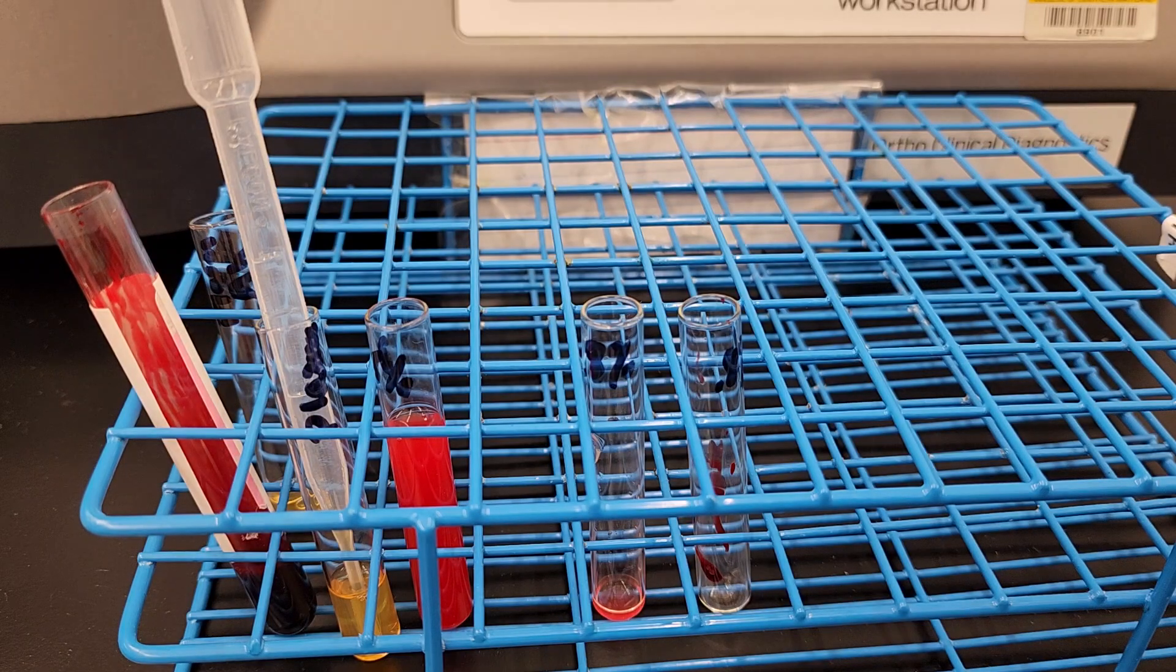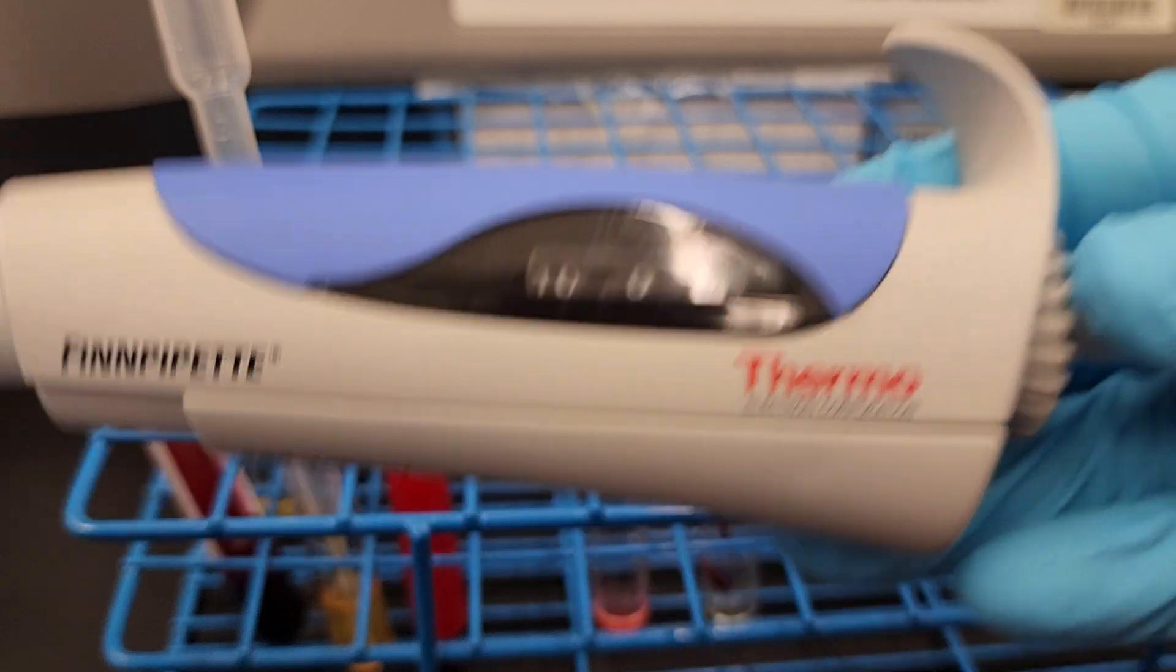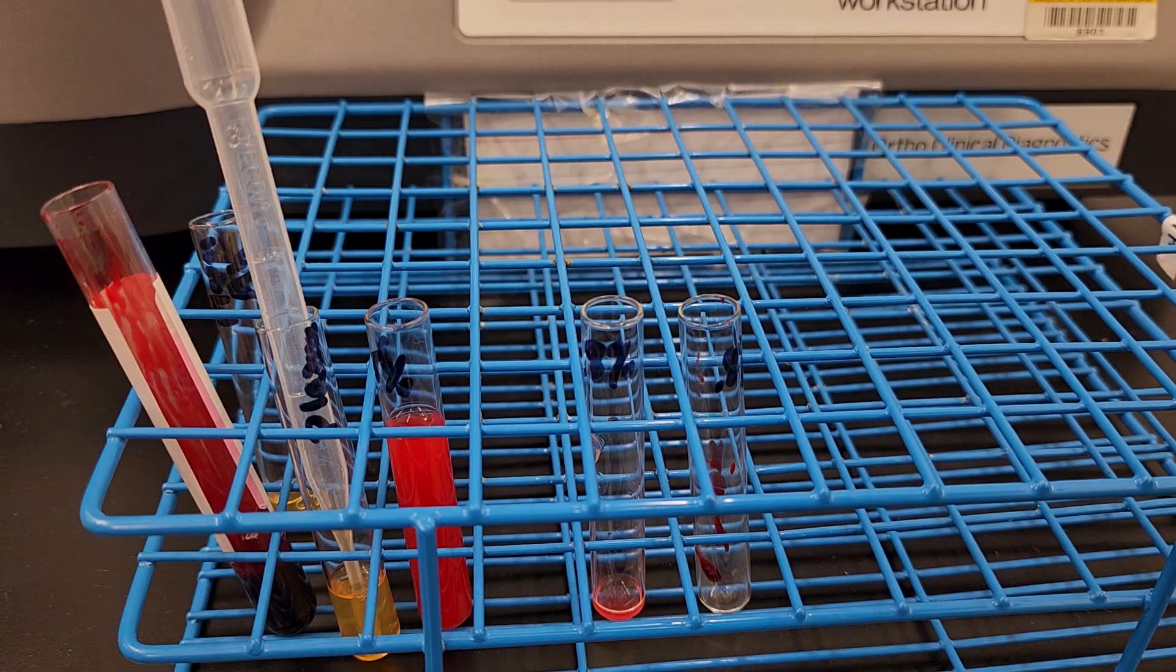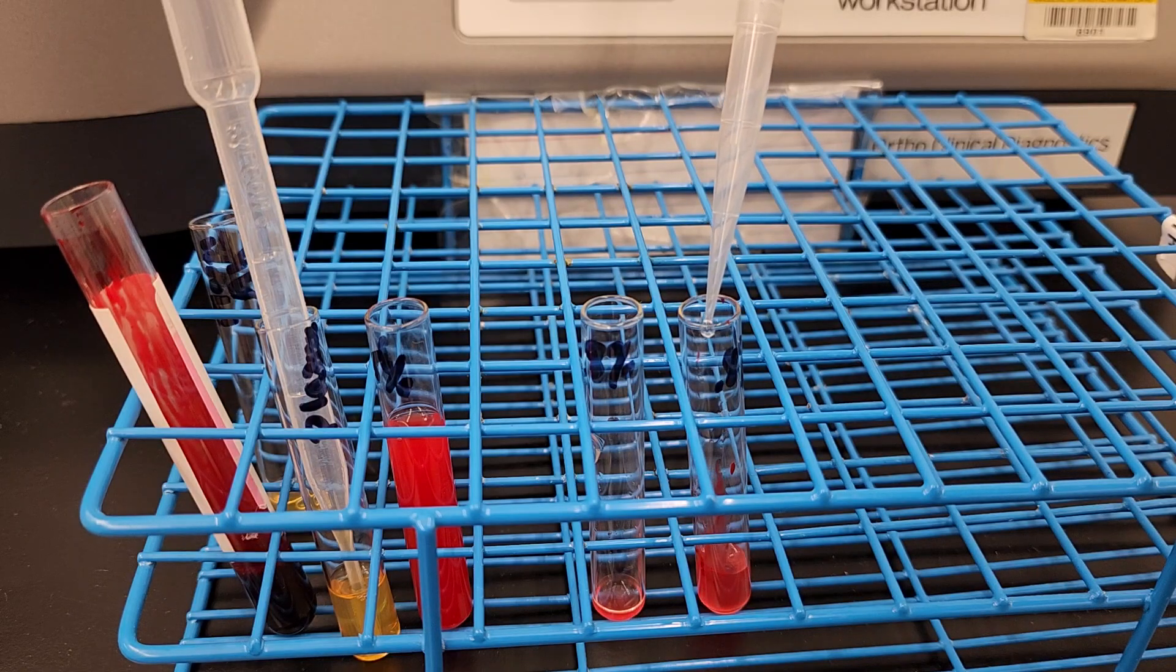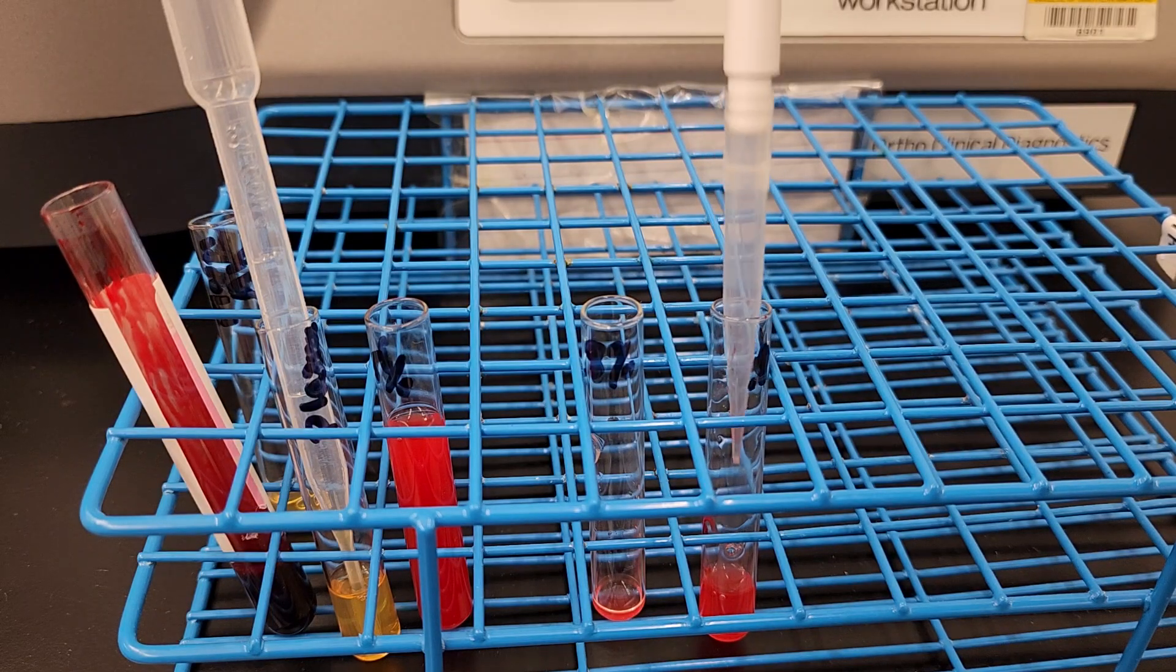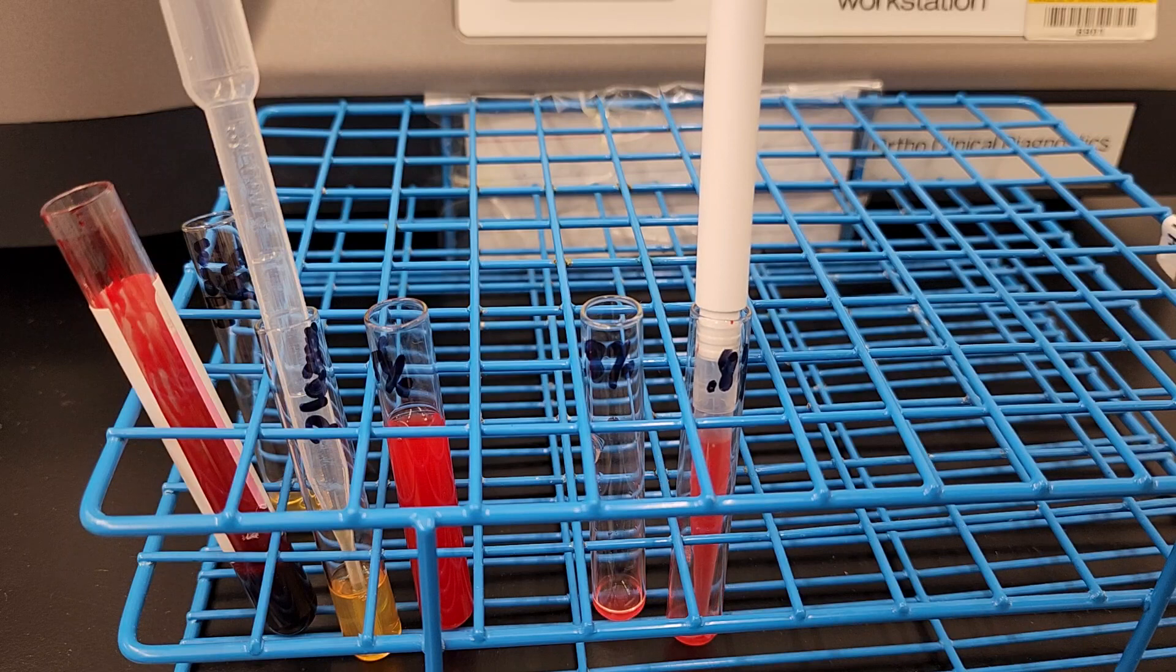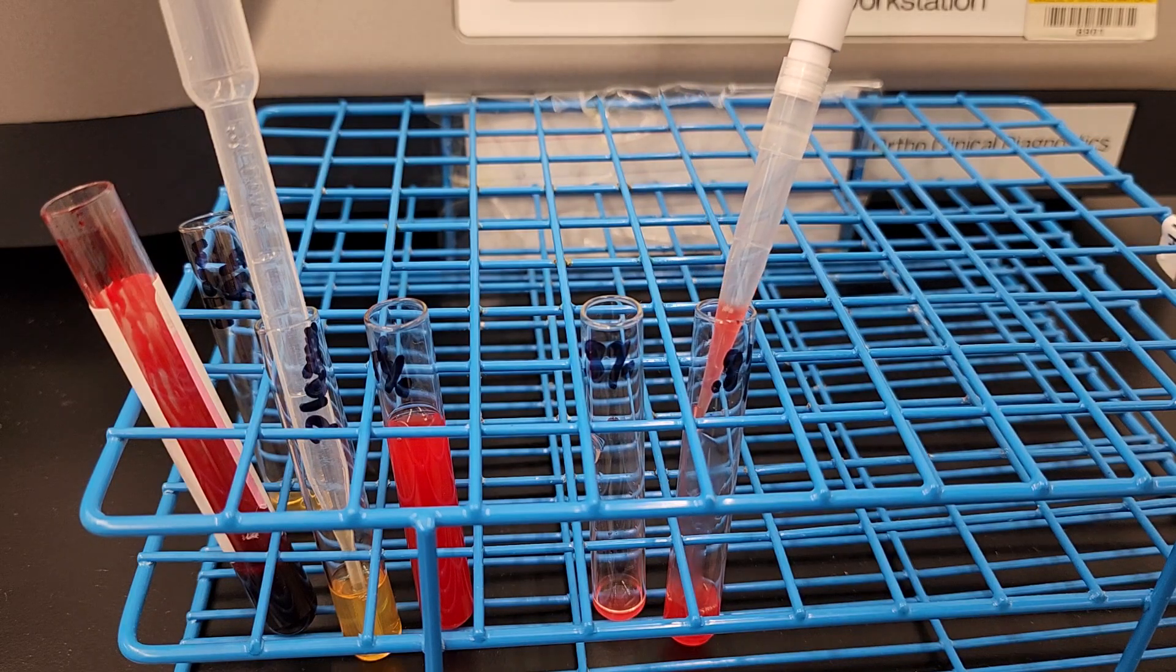And we're going to do 1000 microliters of the saline. All right, so 1000 microliters of the saline. Okay, you can mix this as well. Make sure you're getting all of the cells off of the side of the tube. And now you can see it is much lighter, just like the reagent.